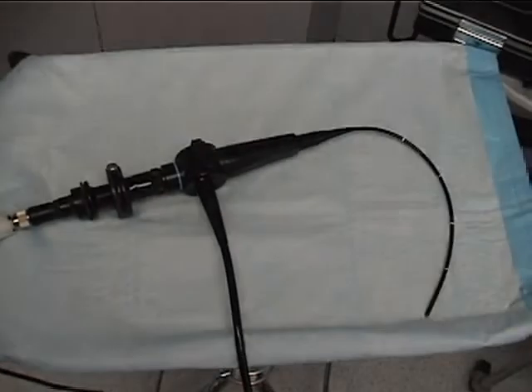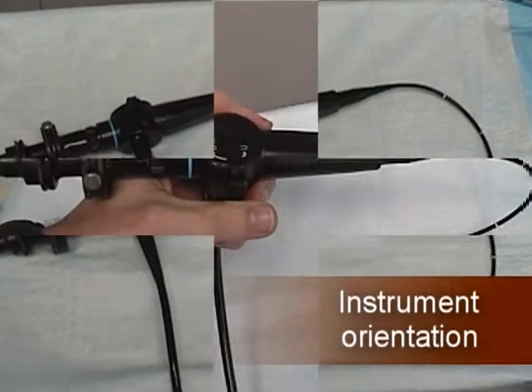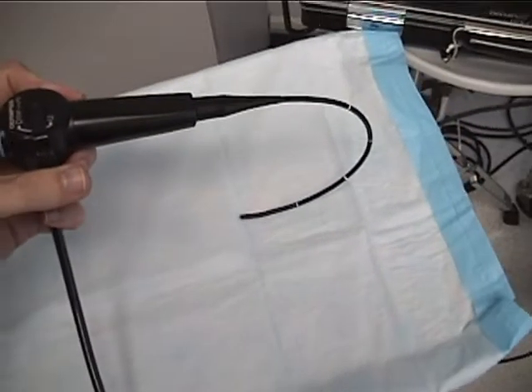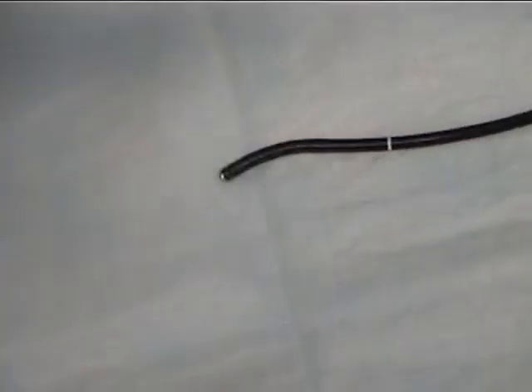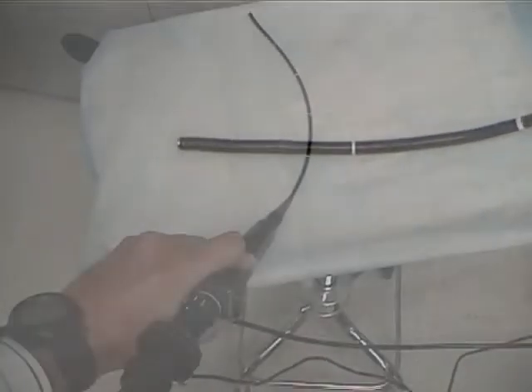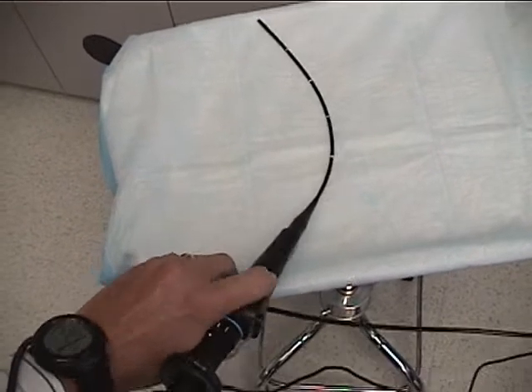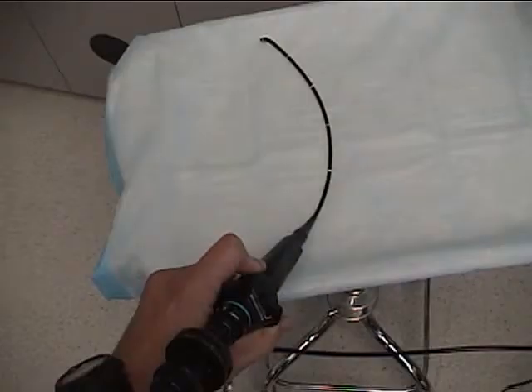The nasopharyngoscope allows the physician to visualize the upper airway precisely in patients who have upper airway complaints. Hold the scope as shown. The dial on the underside of the scope allows for upward and downward movement of the tip of the scope. This up and down movement, combined with rotation of the scope, allows for 360-degree viewing of the airway.